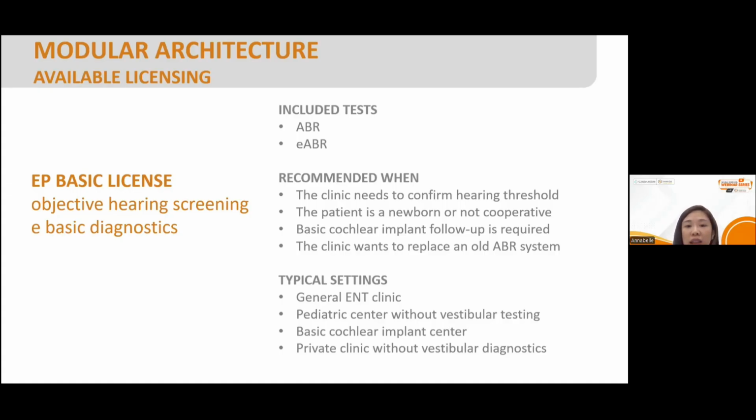If they are not passing the AABR, the automatic ABR, then we go through the referral pathway.